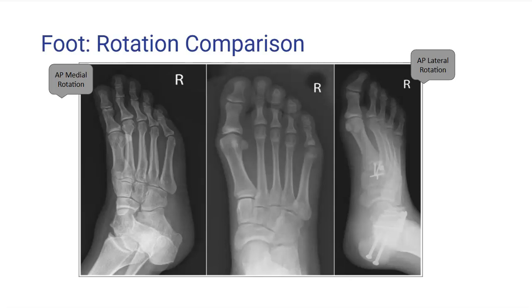This arch causes the medial plantar surface to not always make full contact with the IR. In order to avoid uneven plantar surface pressure and rotation, it is important to position the foot so that even pressure is placed on the plantar surface.